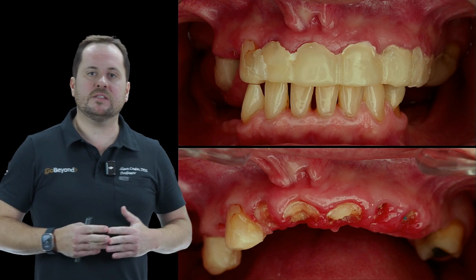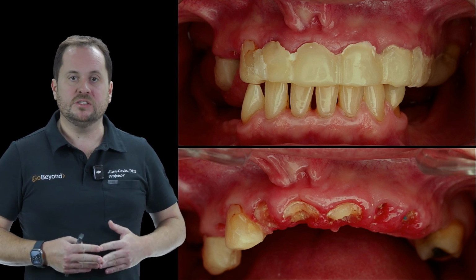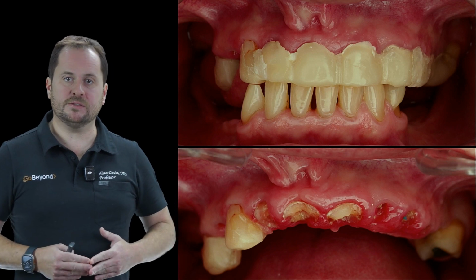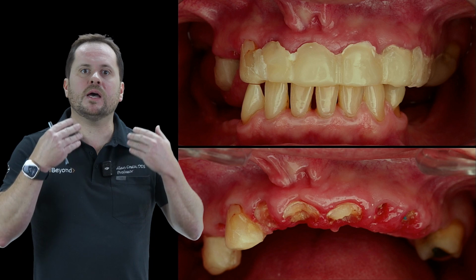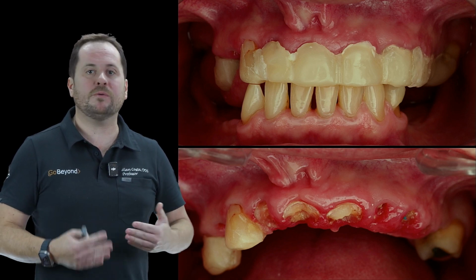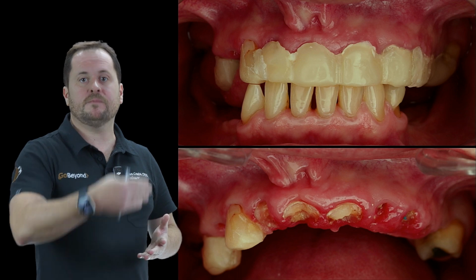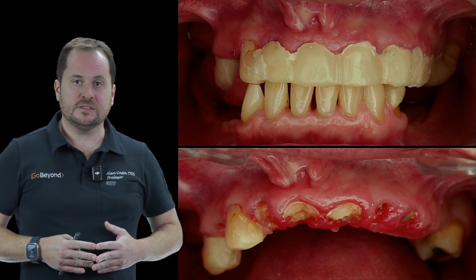What would this adjustment of the environment be? We work with some type of provisionalization for this patient so that we can improve her health condition, allowing her to receive these implants. But you must be wondering, gosh, with an environmental adjustment, making provisionals, I will have multiple expenses related to that. Why should I spend on a temporary prosthesis, since it's not my goal yet? I will have to make another temporary one later when I place the implants.